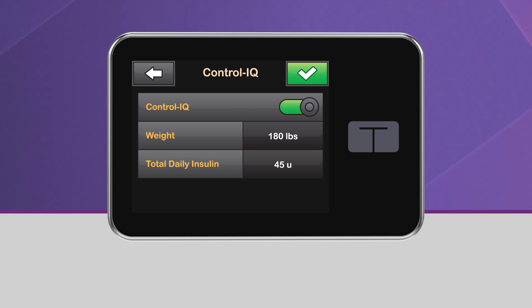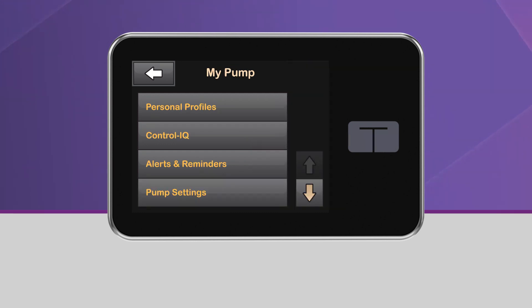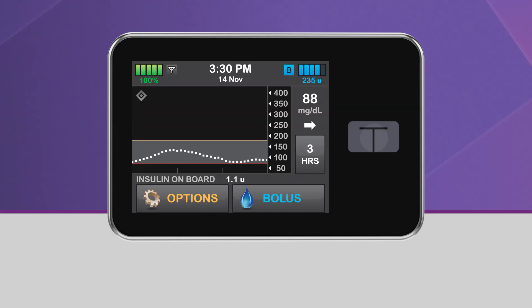Once you've entered your weight and total daily insulin values, tap the green checkmark to save your settings. Control IQ Technology is now on. Return to the home screen by tapping on the Tandem icon. You should now see the gray diamond icon in the upper left corner of the CGM graph. This indicates that Control IQ Technology has been successfully turned on.